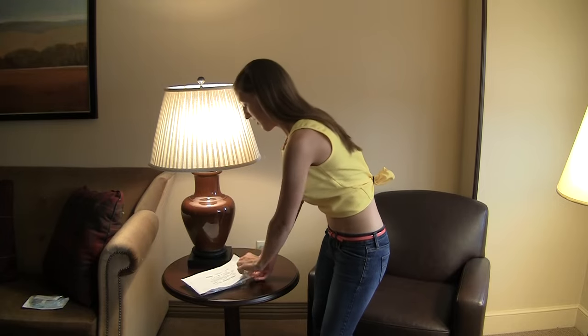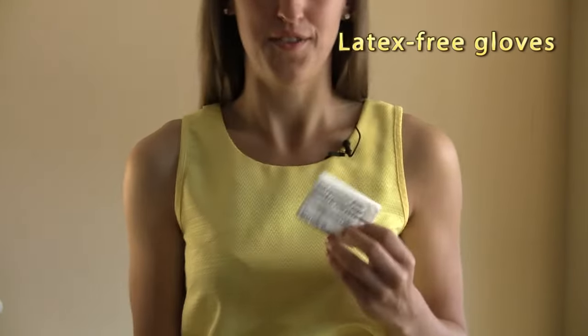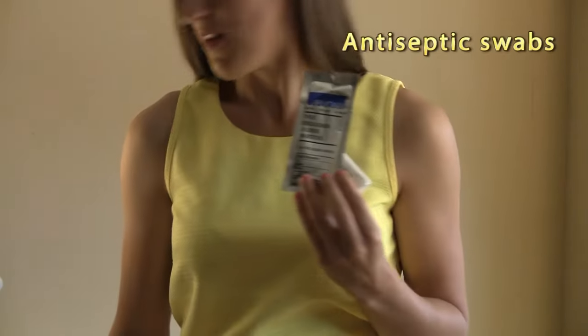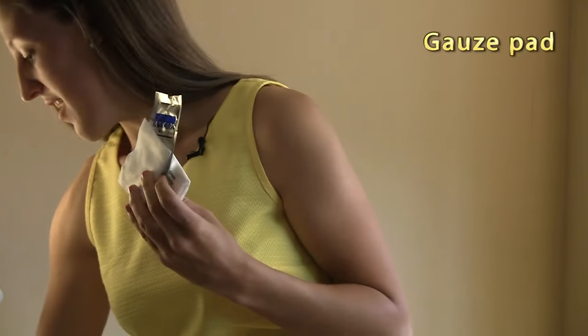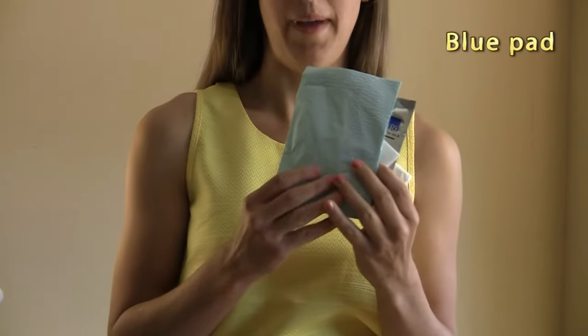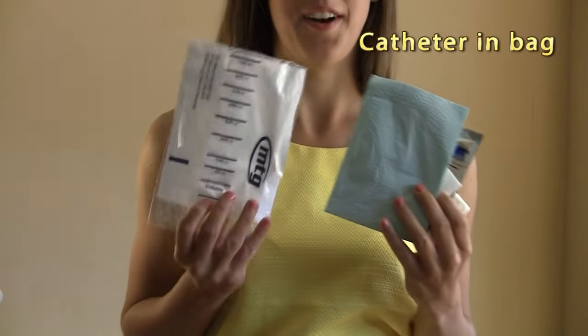So let's see what's in this packet. First I have the latex free gloves, the antiseptic swabs, the gauze pad, the blue pad, and finally the catheter in the back.